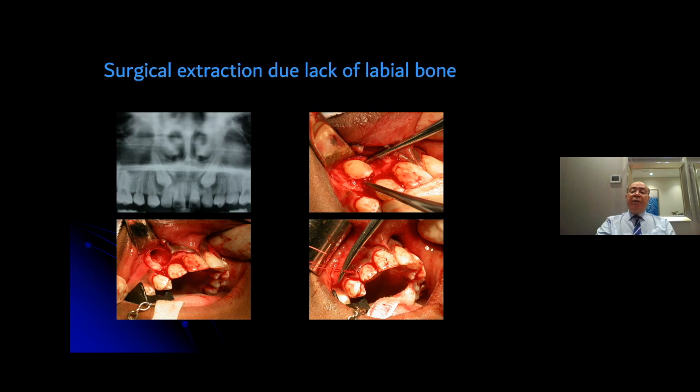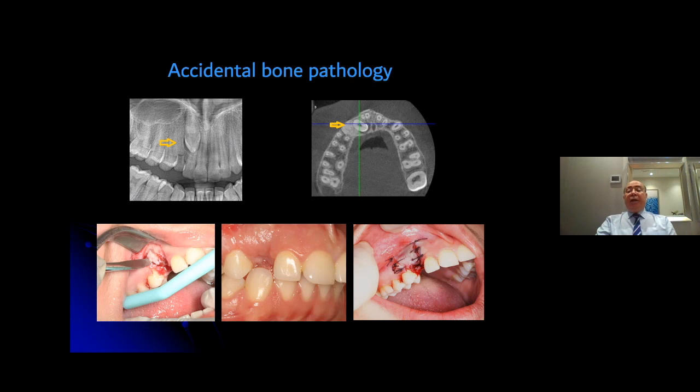In this particular case, again, I did it with Dr. Reem, but I'm not going to mention everything because she's going to say it in a different lecture, inshallah. This is one of the patients who was seen at the ortho department, and accidentally, opposite the yellow arrow, you see some density of the bone. The initial diagnosis of possible dysplasia or bone pathology was made.